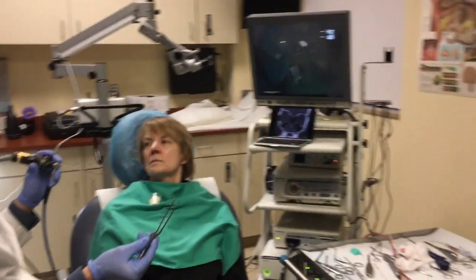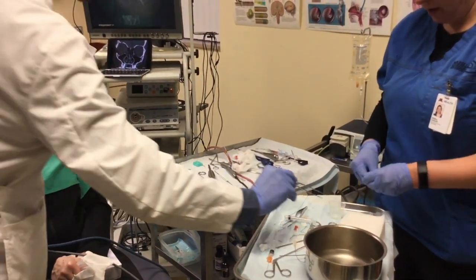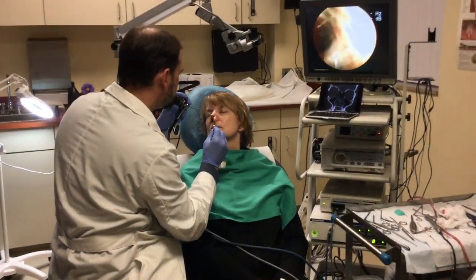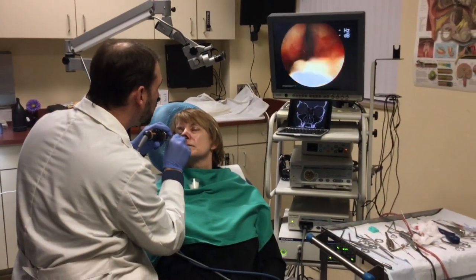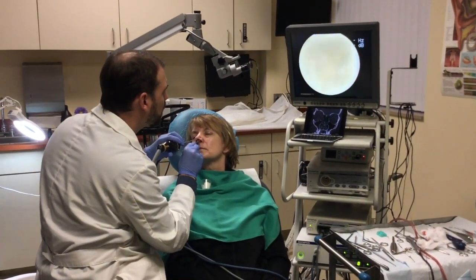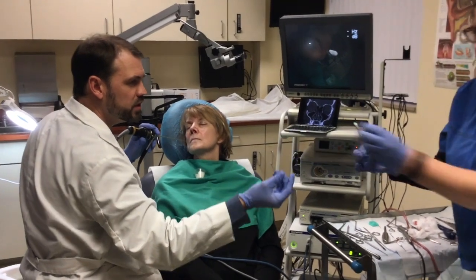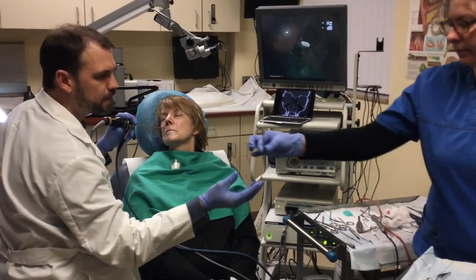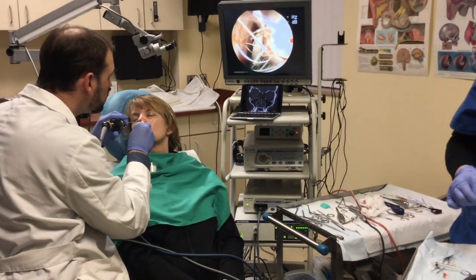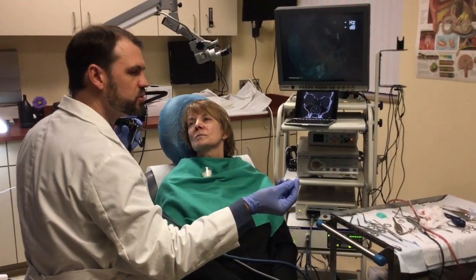Okay, so I'll take the dressing. Why don't you cut it into three, and then we'll do another one cutting into three. This is absorbable. It'll absorb. Dunk. Yep.